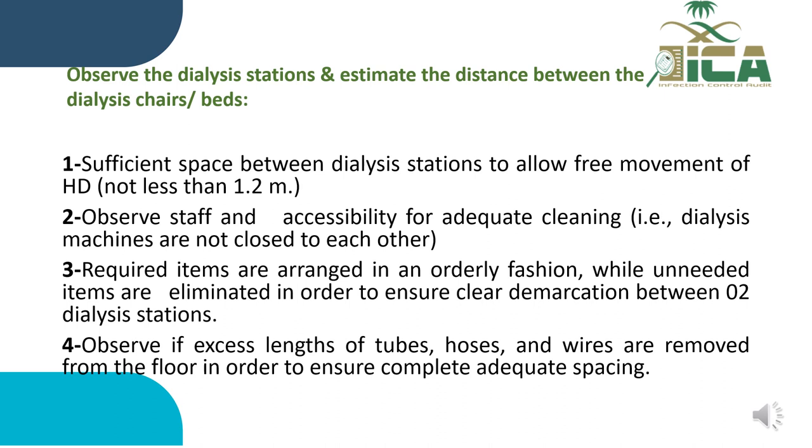For example, dialysis machines are not close to each other. Number three, required items are arranged in an orderly fashion, while unneeded items are eliminated in order to ensure clear demarcation between two dialysis stations. Number four, observe if excessive lengths of tubes, hoses, and wires are removed from the floor in order to ensure adequate spacing.